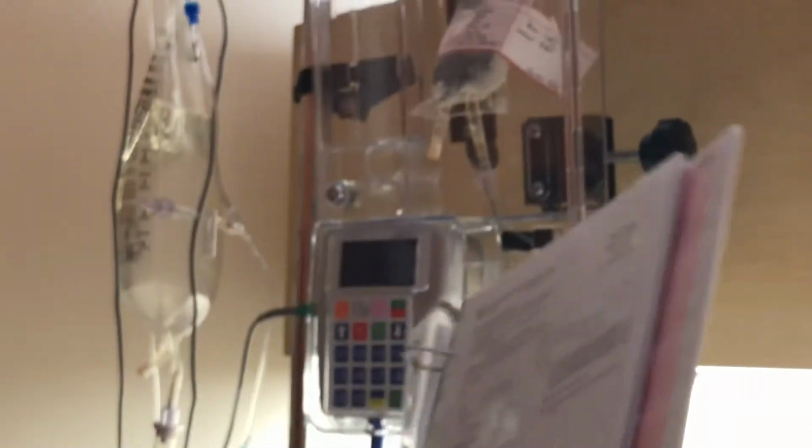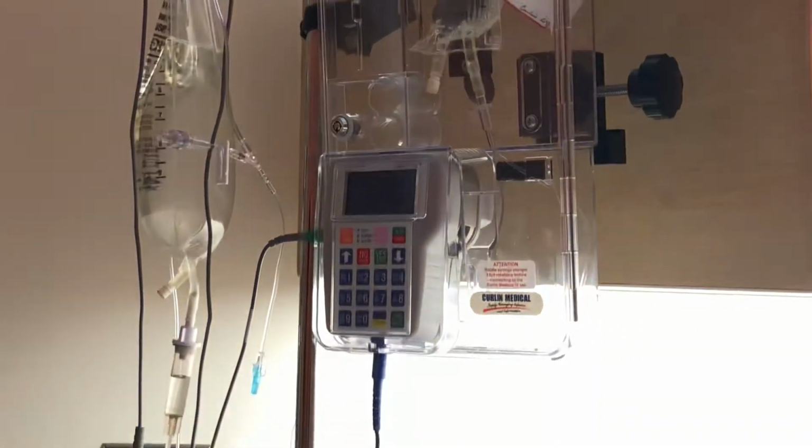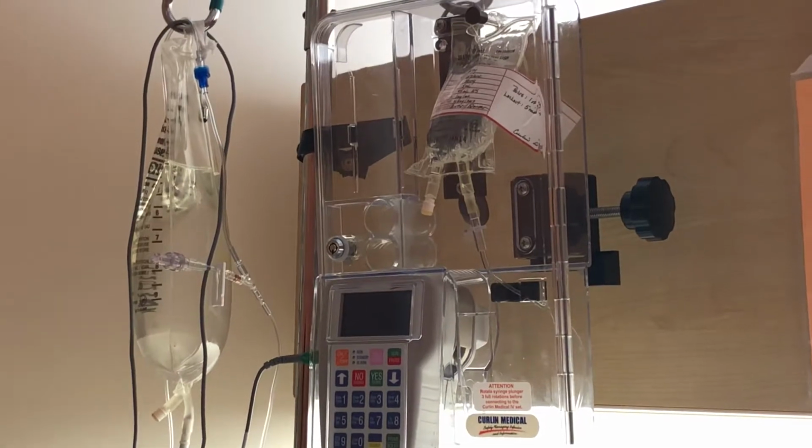And right time, it's 10:30 and it's due now. And right reason, the patient has severe pain. Right education, so you are receiving morphine because of pain. And I know the patient has a right to refuse this medication as well.